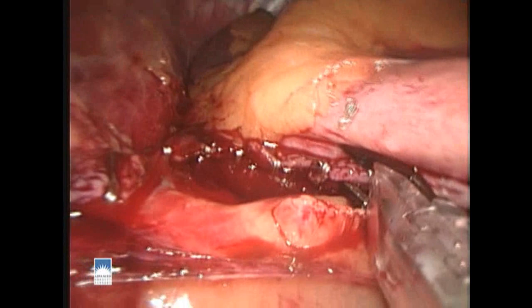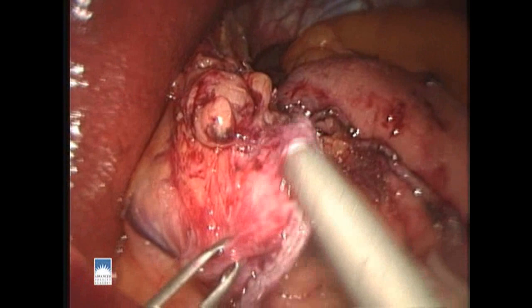We use Hemoclips to control oozing from the staple lines. We then use our fibrin glue along the staple lines as well, and this adds extra security.